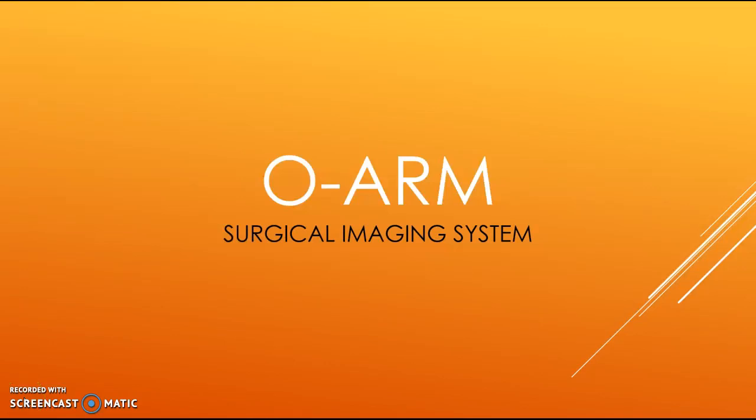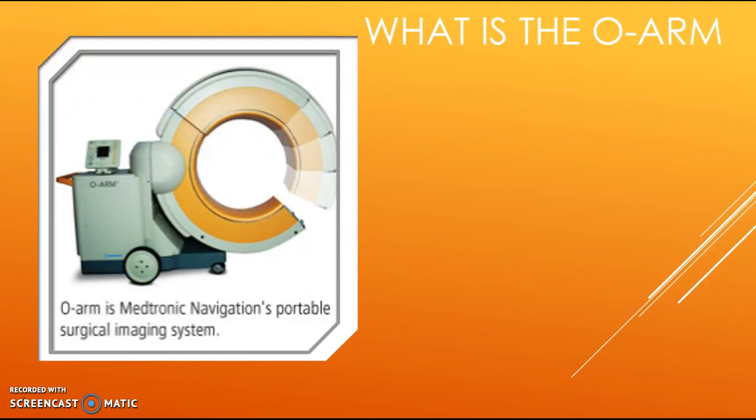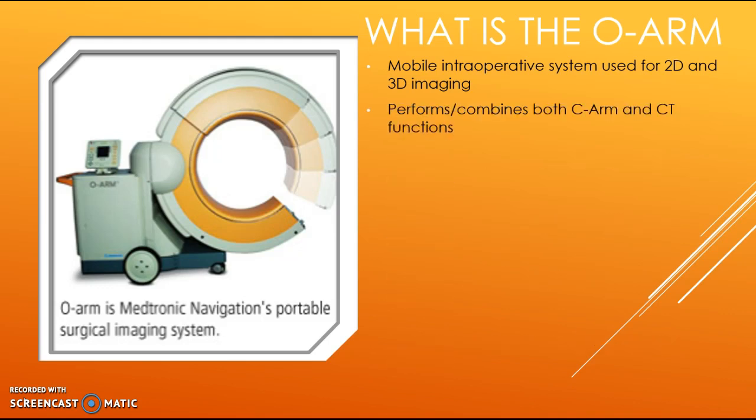This presentation is about the O-arm surgical imaging system. So exactly what is the O-arm? The O-arm is a mobile intraoperative system used for 2D and 3D imaging. It combines both C-arm and CT functions.